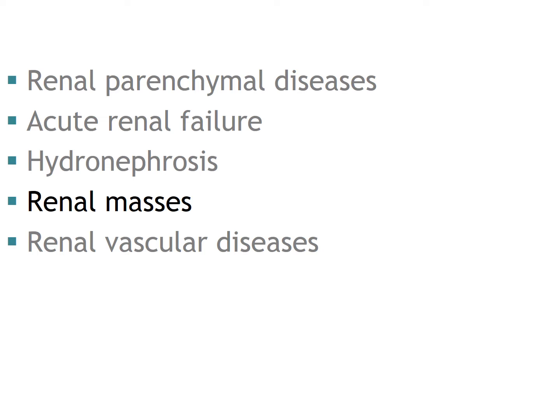I will talk on use of spectral Doppler ultrasound in evaluation of renal masses in another session, and will not talk here. Now let's move on to Doppler ultrasound in renal vascular diseases.